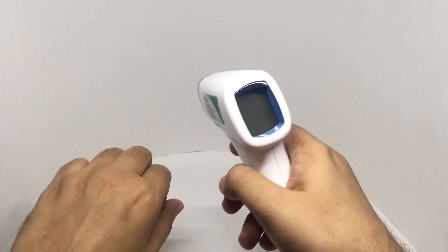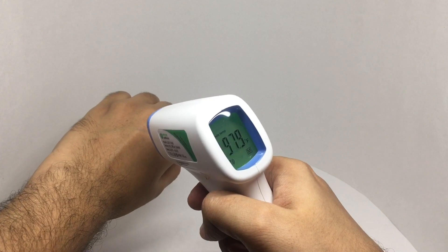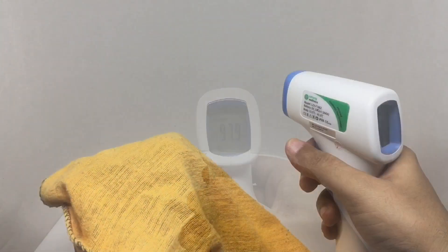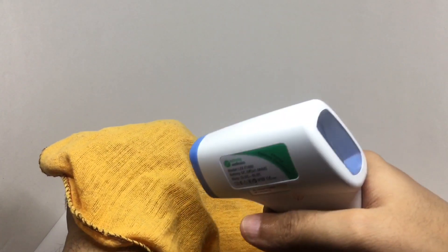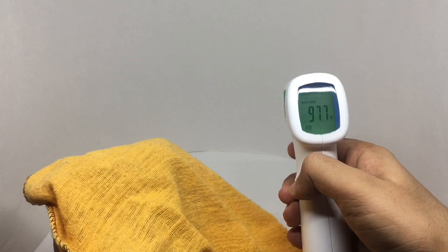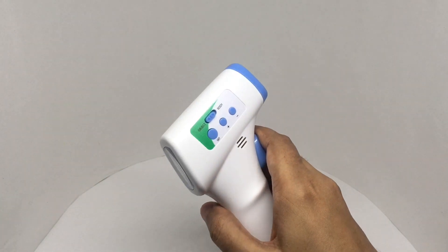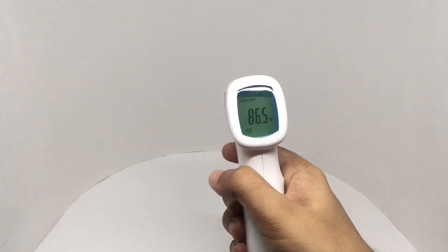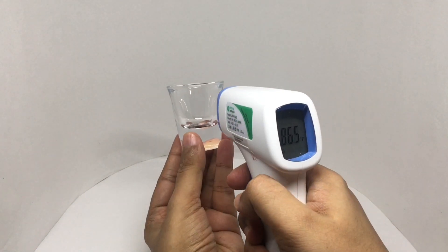Let's see how it works. That's the body temperature reading. Let's see if it can read through thin cloth — looks like it can. Switching to object mode, that reads 86.5 degrees. Let's also try it on this glass.